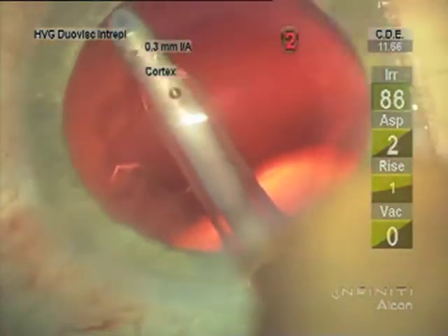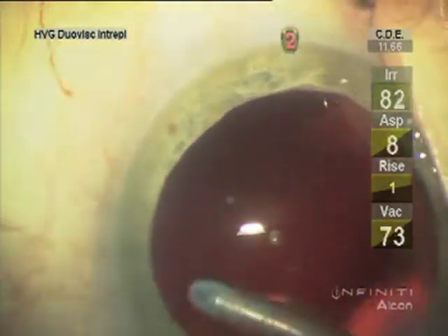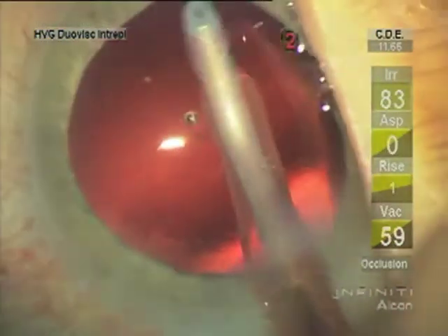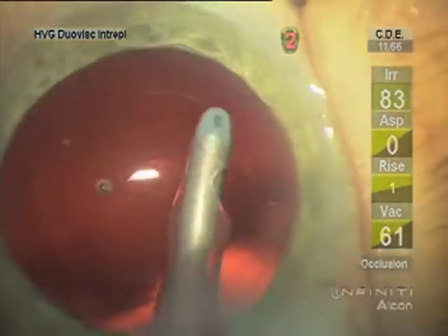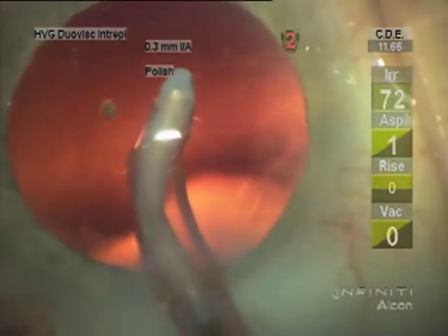I then turn the vacuum down again for lens epithelial cell removal. This silicone IA tip — the curved tip — is what I prefer to reach more of the circumference; usually about sixty percent of the circumference I can clear lens epithelial cells. I do this to try to prevent capsular phimosis. Dr. Apple pointed out that this does not reduce posterior capsular opacification — that's equatorial cells that create those Elschnig pearls — but fibrosis is what can cause a phimosis.